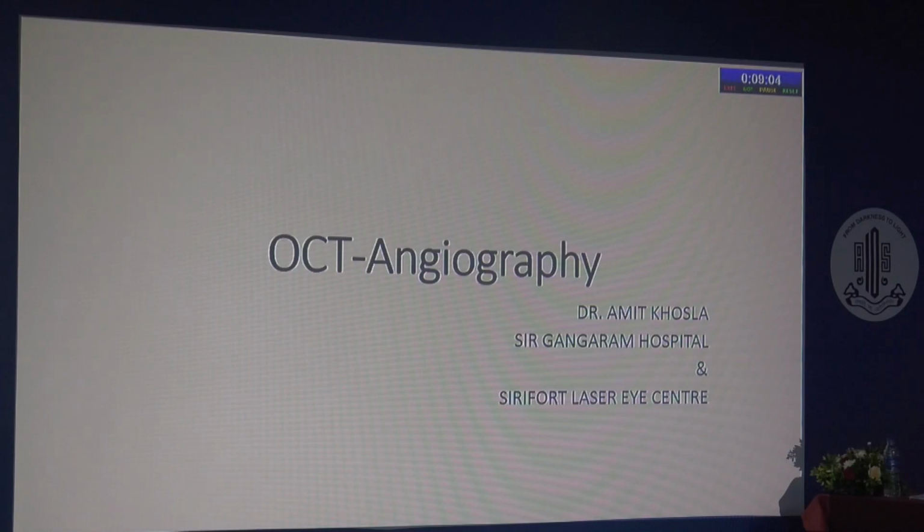Number 3, all of you are doing premium lenses. So for premium lenses, even a toric, get an OCT done before, because you may have some membranes and the patient will not respond. One of the unhappy patients after cataract surgery is a patient whose OCT hasn't been done. Normally you end up doing an OCT after the surgery; get it done before the surgery if you're doing premium or patient expectancy is higher.